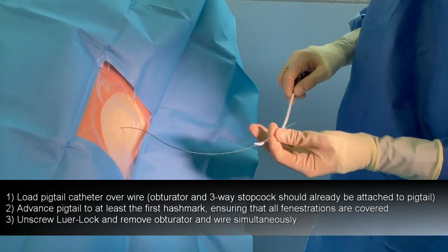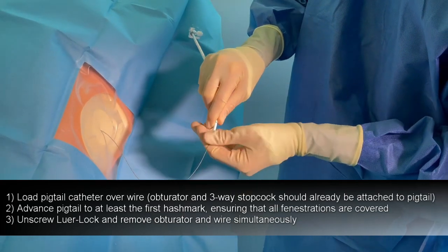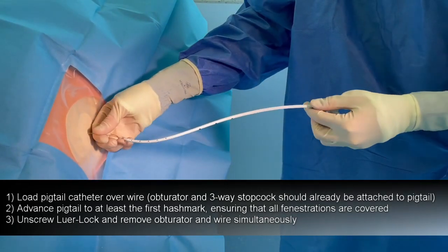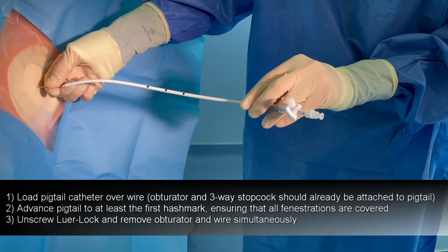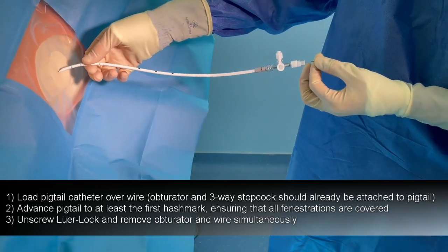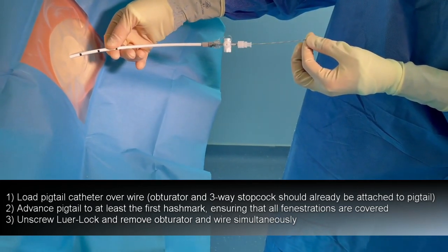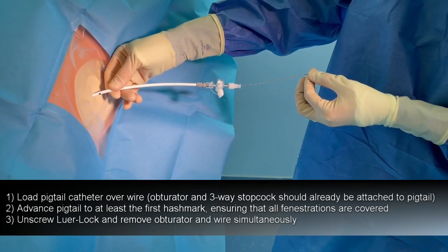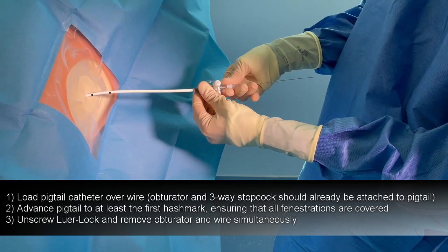Then, load your pigtail catheter with the obturator already in place over the wire. You may need to back the wire up so that the wire comes out the end of the pigtail. Advance the pigtail until all holes are covered and to the hash marks — the first hash mark marks 5 centimeters from the holes. Then remove both the obturator and the wire simultaneously.